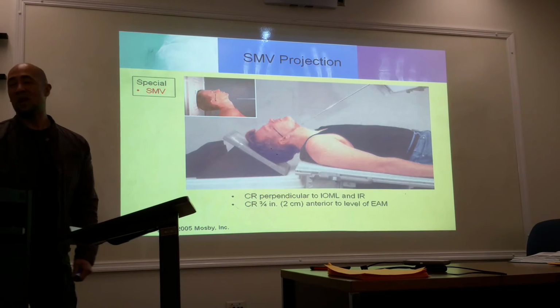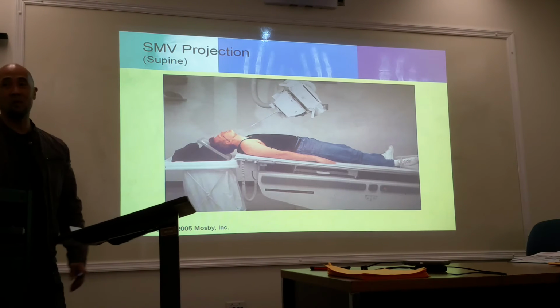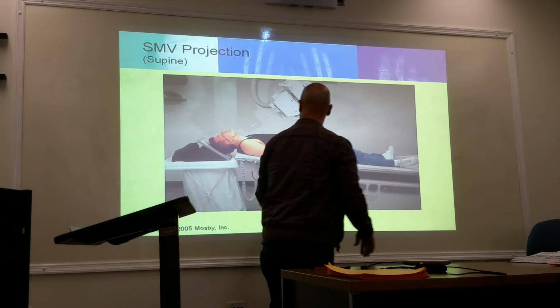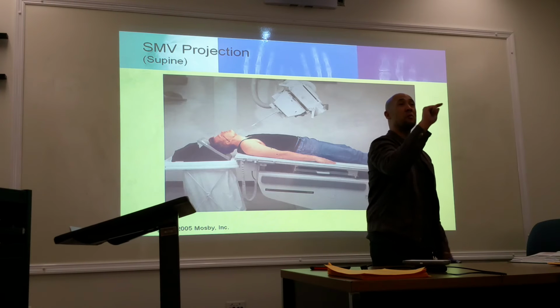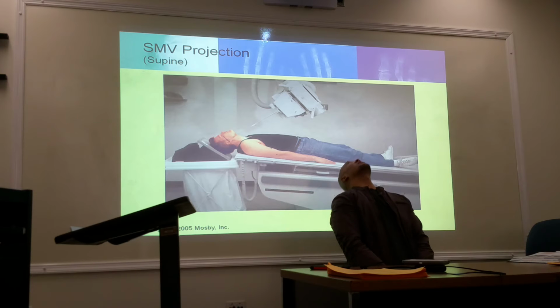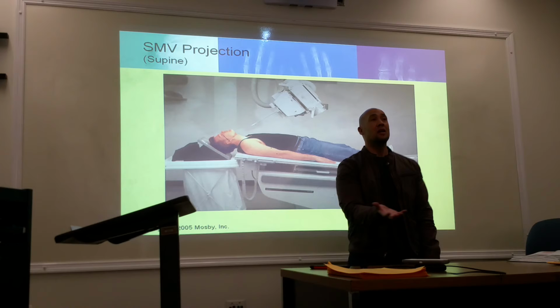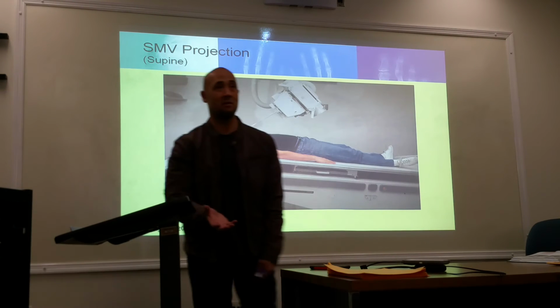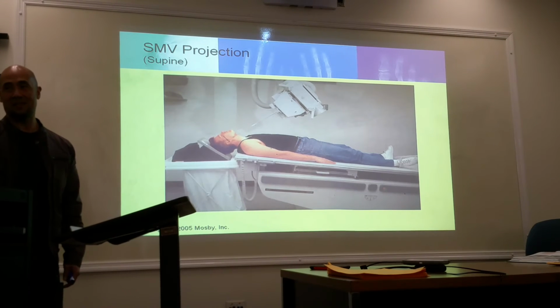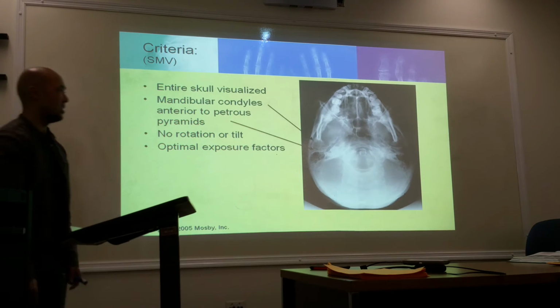All right. You have to go through this very, very quickly. It is tough to do. They're even using a trash can to hold the image receptor. When we practice in the rooms, you will be sitting on a chair. When you have the chair underneath your patient, don't use a chair with wheels. Make sure it doesn't have any wheels. We will practice this. I'm just going to show this to you now; it's better demonstrated in the lab.